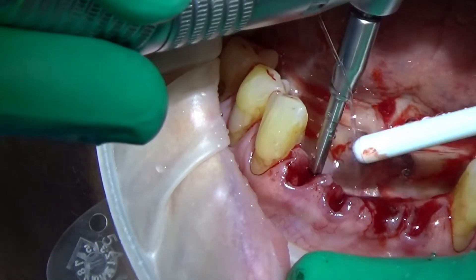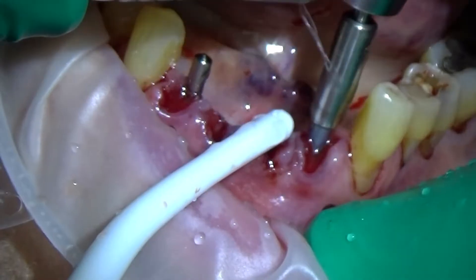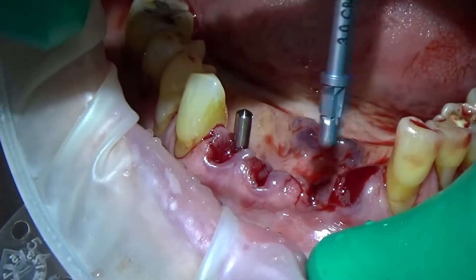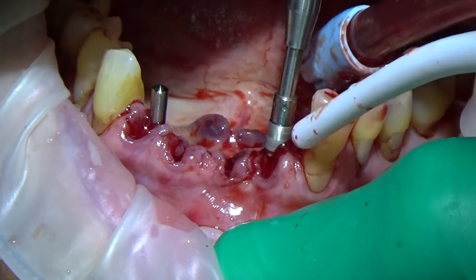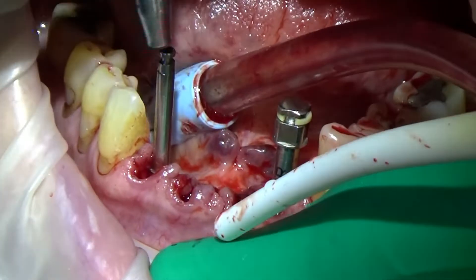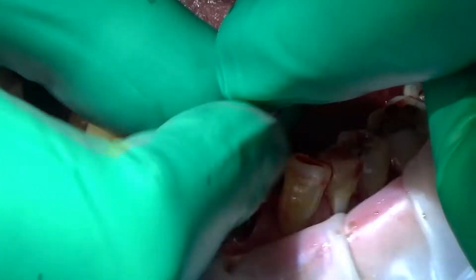The coronal part of the drill sits towards the lingual so that you can have a screw-retained restoration. We're just going through the normal drill kit and getting a feel for the bone. I'm keeping some bone from the drills — it's going to look like they're closer on the x-rays than they really are because of the parallax effect. Here I'm using the countersink. This is a 3 by 12 millimeter implant from BioHorizons, putting on our healing abutments.